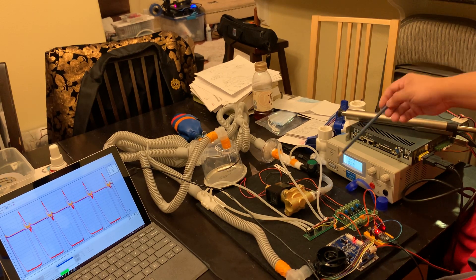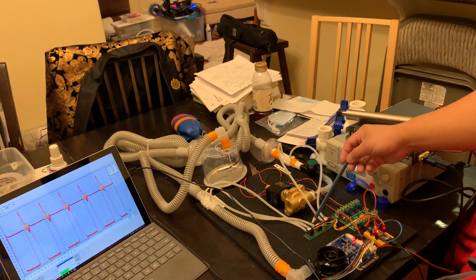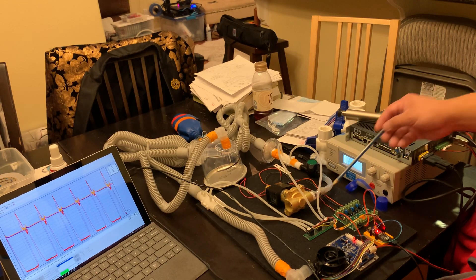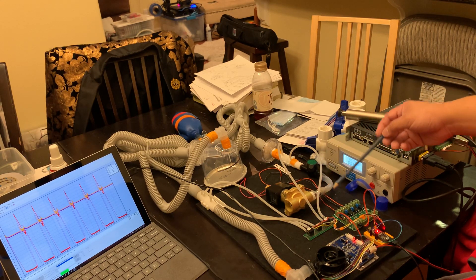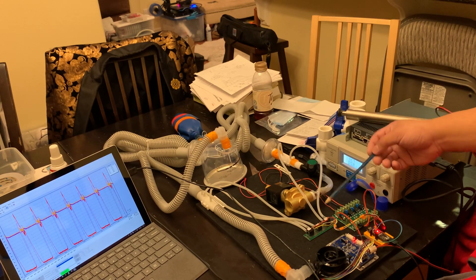We've also replaced all three of our pressure sensors — our two differential pressure sensors for inhalation flow and exhalation flow, as well as our patient pressure sensor. These sensors have been replaced with units that are better suited to the range of pressures that we are measuring, which gives us better sensitivity, more signal, and less noise.